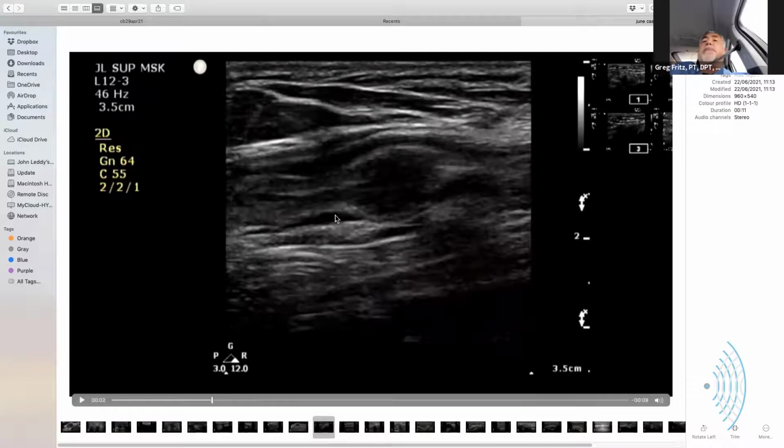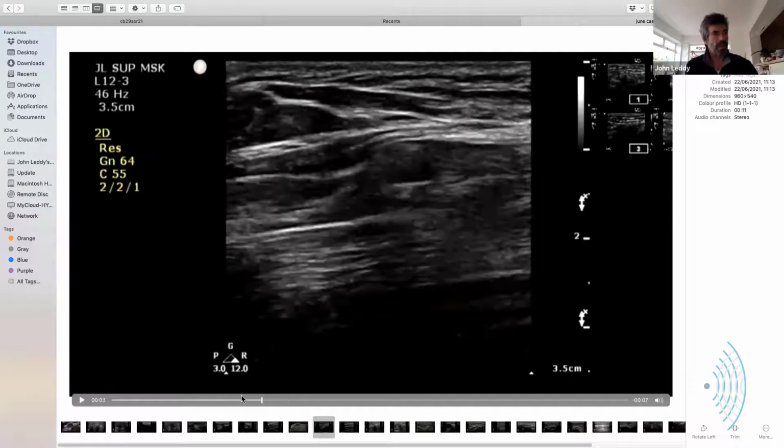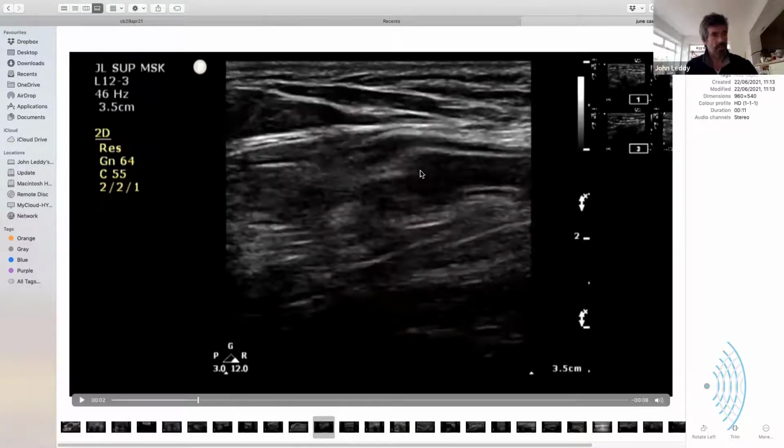I can see the loops. Yeah, I wished I could see the bowel, but that is the bowel, that tubular thing running through with all the fat. So it's fat going through, and then a piece of bowel. There's the bowel wall. These are the lining of the bowel wall.